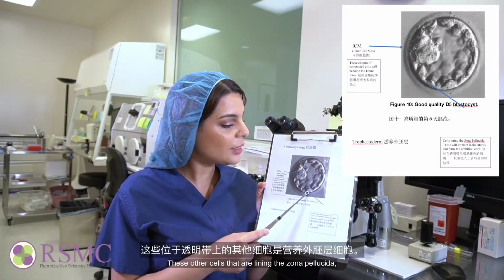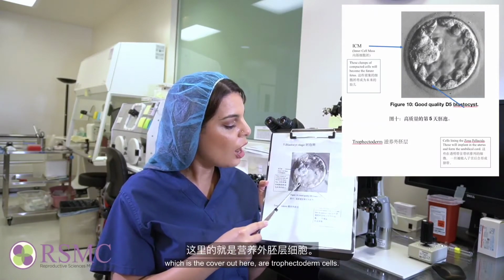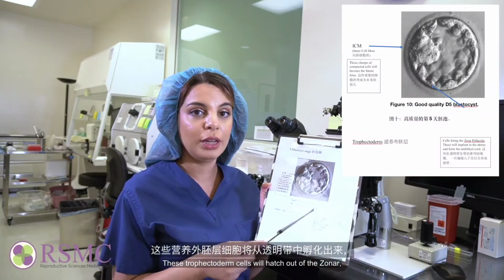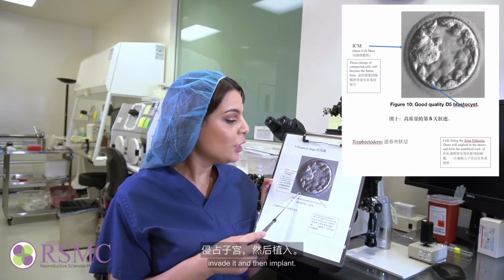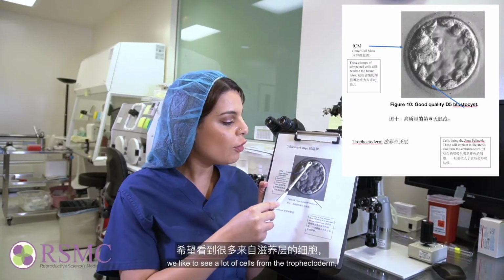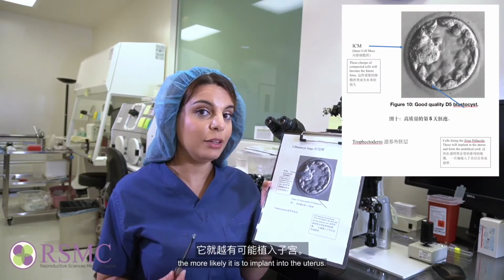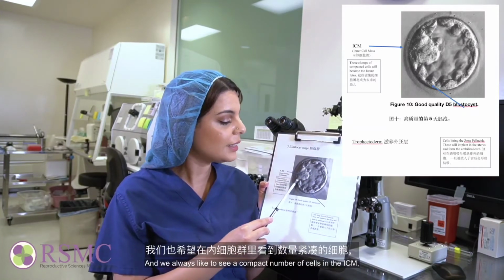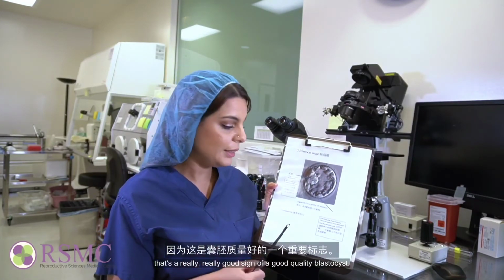These other cells that are lining the zona pellucida, which is covering out here, are trophectoderm cells. These trophectoderm cells will hatch out of this zona. They will go to the uterus, invade it, and then implant. So basically what we always like to see, we like to see a lot of cells from the trophectoderm because the more cells we have, the more likely it is to implant in the uterus. And we always like to see a compacted number of cells in the ICM. That's a really, really good sign of a good quality blastocyst.